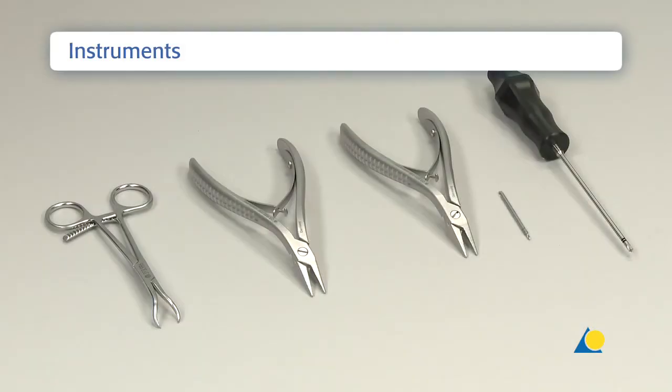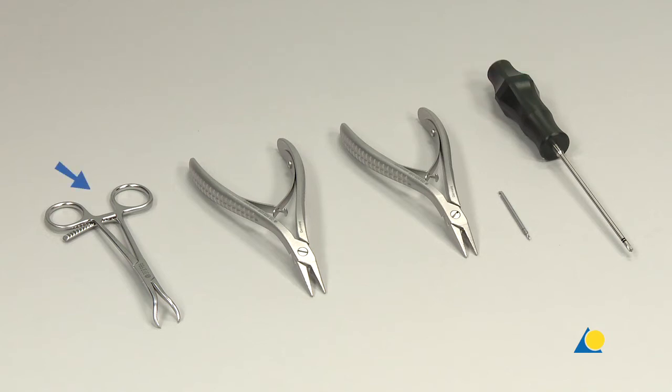The instruments needed are the reduction forceps with points, two bending pliers, the 1.5 mm drill bit with 6 mm stop, and a self-holding screwdriver.